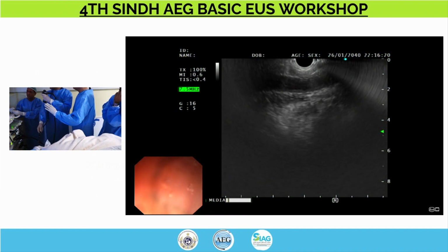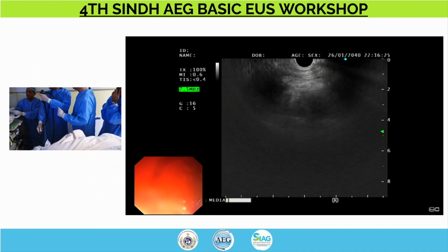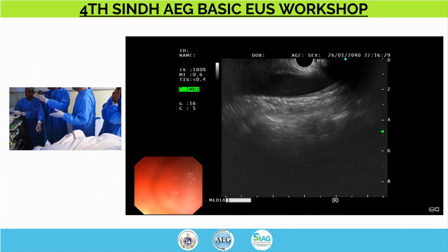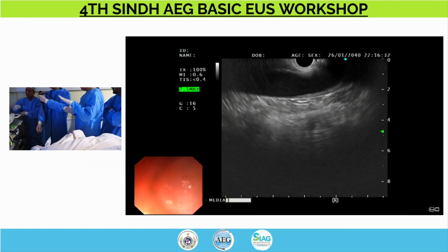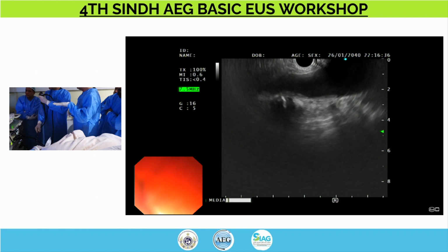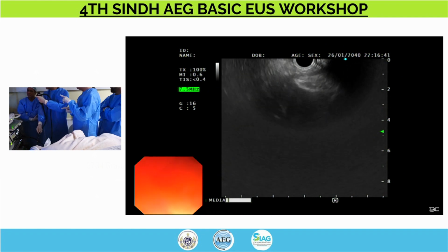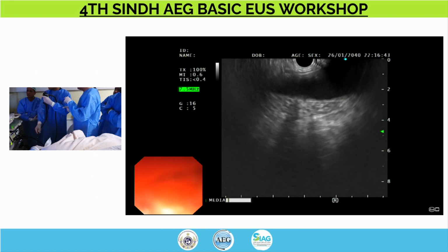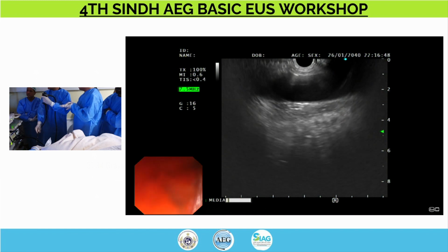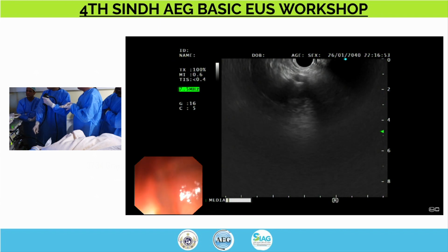Now follow the aorta. Look at the celiac takeoff. Follow the aorta, push along the aorta while keeping it in view. The important thing here is that whatever you have made your reference, keep that thing under your transducer unless you find a new reference. So right now your reference is the aorta. While the aorta is underneath your transducer, move forward from that reference point till such time that you are ready to jump to the new reference point.